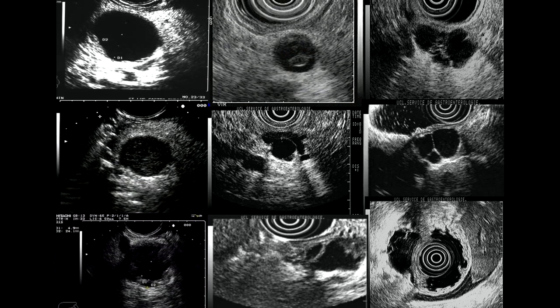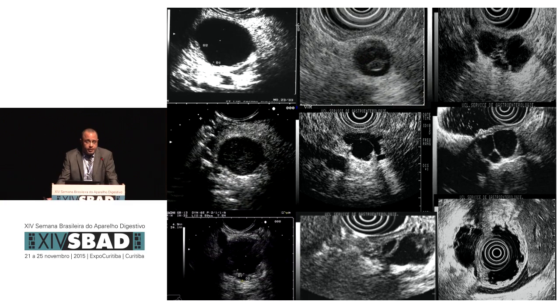The cysts come in different shapes, configurations, communication or no communication to the duct, with masses or without masses inside the cyst. It's not easy just to look with one imaging modality and figure out what we are dealing with, but my job here today is hopefully to help you make a differential diagnosis, narrow it down with the information that we can get with different modalities, including endoscopic ultrasound.